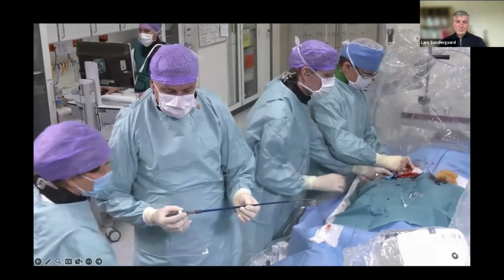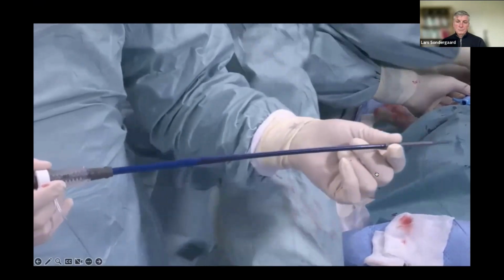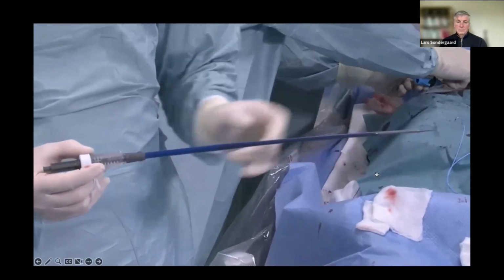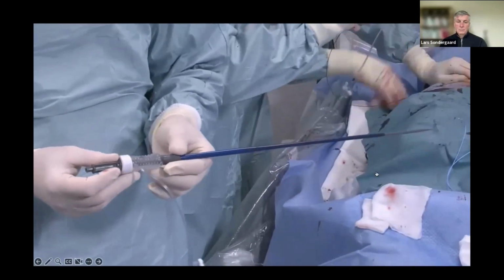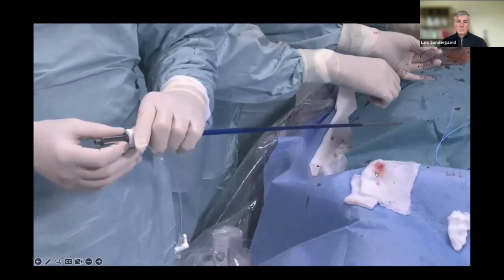It's a sheath here coming from Boston Scientific. It's coming in a 14 French profile, and as you introduce your valve through it, it's going to expand up. It's extremely hydrophilic, I would say. You need to suture it to the skin, or you need to have a good grip on it when you remove balloons or a delivery system from it, for it not to come out.